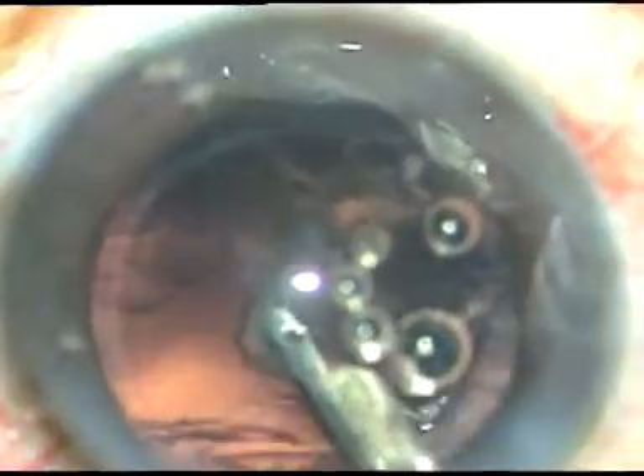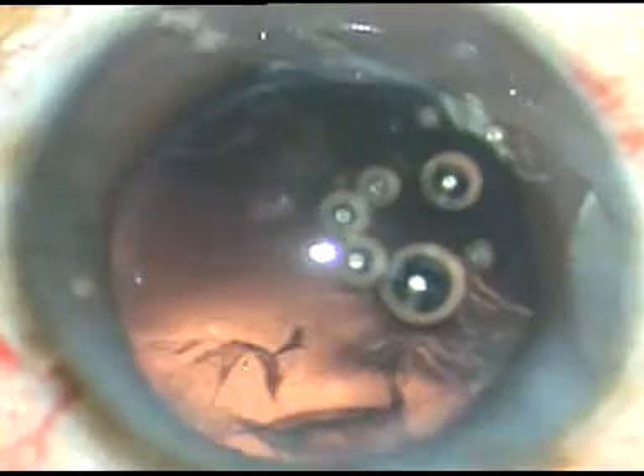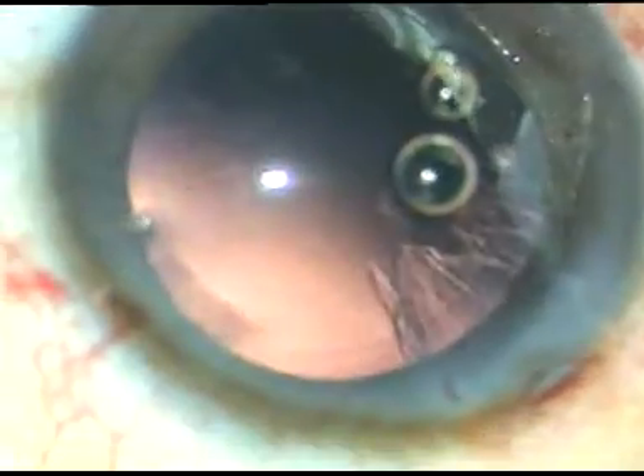Sometimes you cannot aspirate the lens matter easily. Then you come out and flush out the lens matter, go back in and aspirate. Whenever some cortical matter blocks the aspirating port of the Simcoe cannula, just come out and flush out. This sub-incisional cortex can be easily removed by going through the side port.